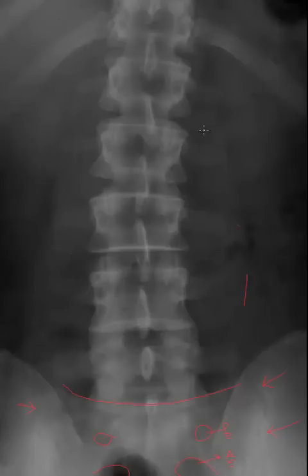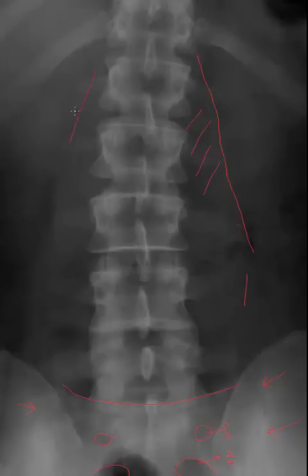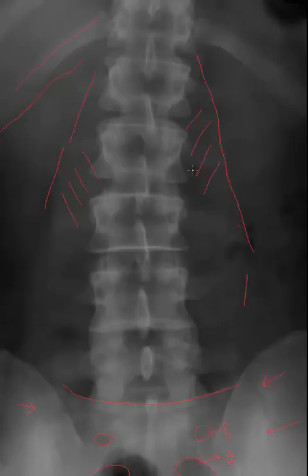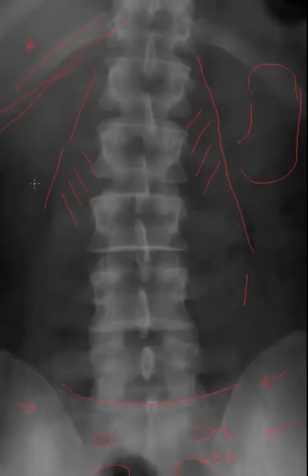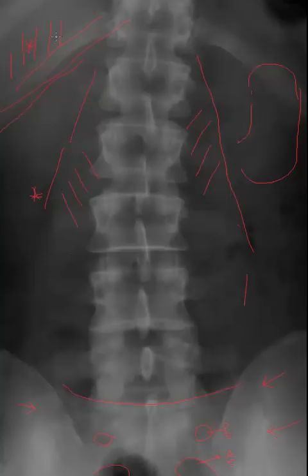We can also see the shadow of the psoas. Here is the margin of the psoas musculature, and you should be able to see it very well. Certain conditions can obscure the psoas shadow, such as spinal infections and ascites in the abdomen. We can also see ribs and sometimes the kidney shadow in that vicinity. The grayness in this area is caused by the liver. In the abdomen you'll see a variable amount of bowel gas, so be aware that lucencies can mimic lesions in bone — if you can follow the shadow outside the bone, you can confidently call it bowel gas.